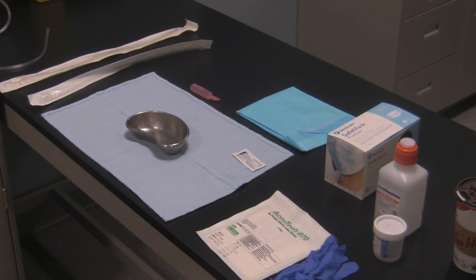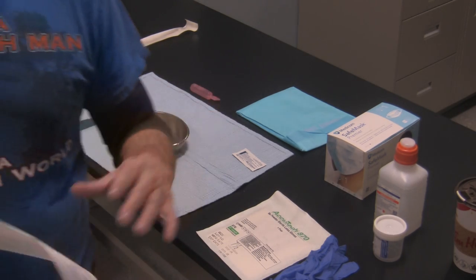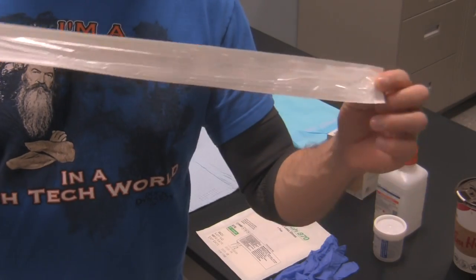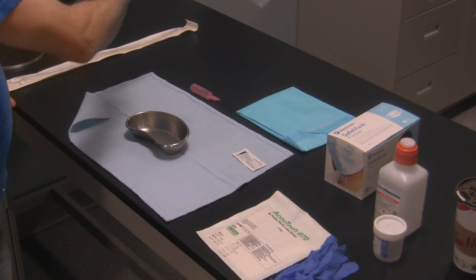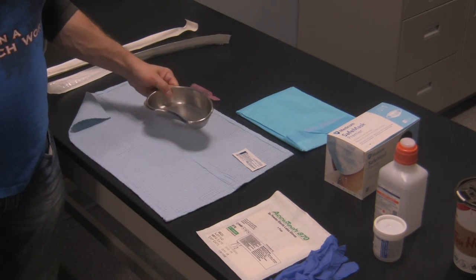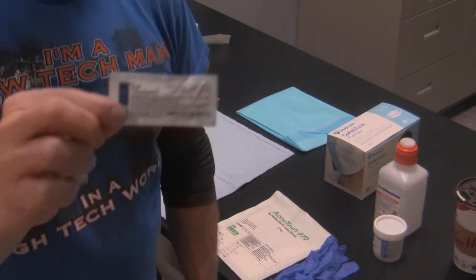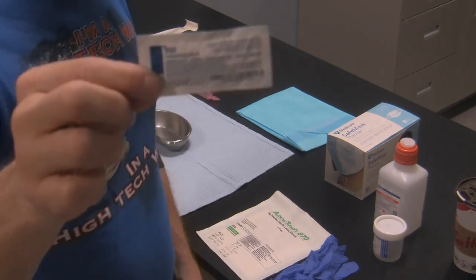Some of the equipment you'll also require: suction catheters, since you're going nasally. Use sterile catheters if it's a sterile procedure and adhere to clean technique if it's a clean procedure. You may also require a kidney basin and some sort of lubricant for the catheter — a water-based gel — so it's easier for the patient to tolerate.